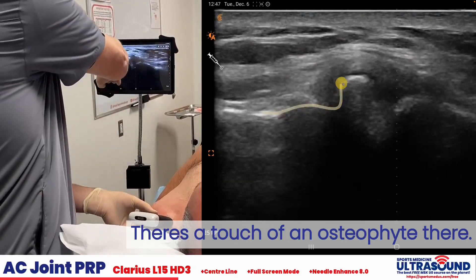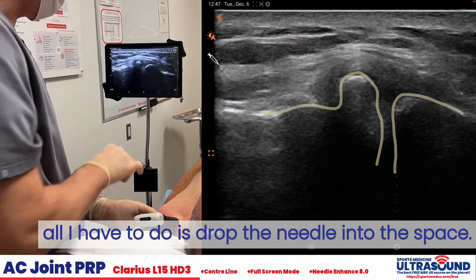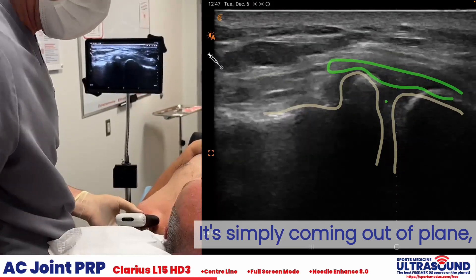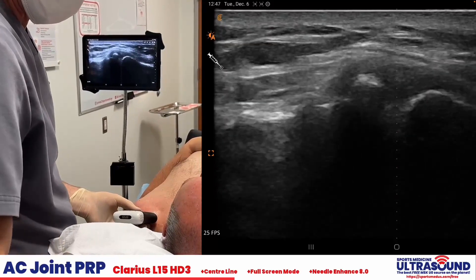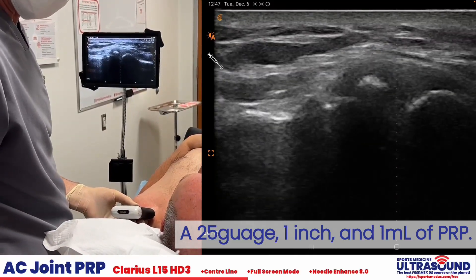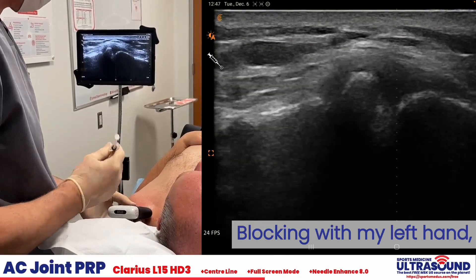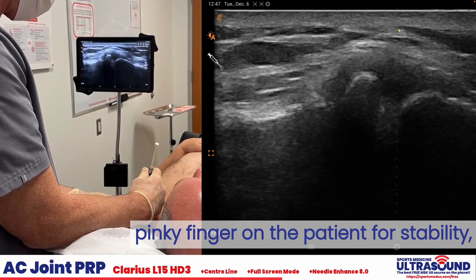A touch of an osteophyte there. For an intra-articular injection, all I have to do is drop the needle into this space. It's simply coming out of plane anterior to posterior — 25 gauge, one inch, and one milliliter of PRP. Lock in with my left hand, pinky finger on the patient for stability.